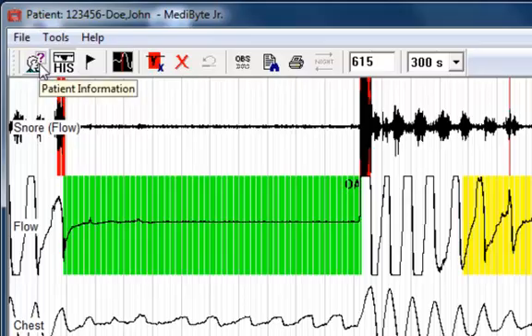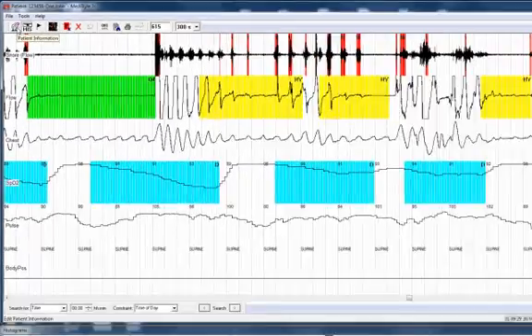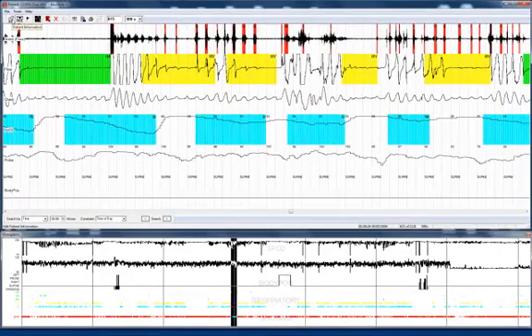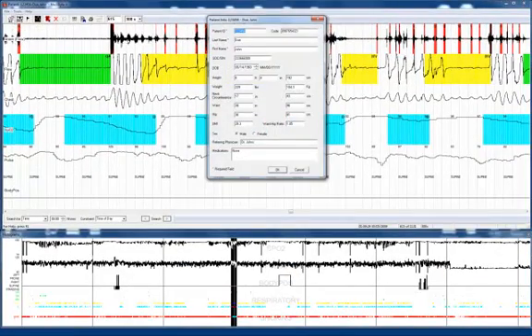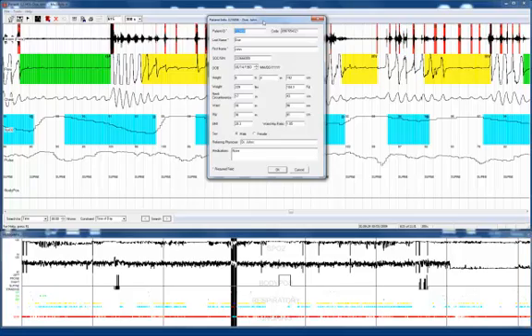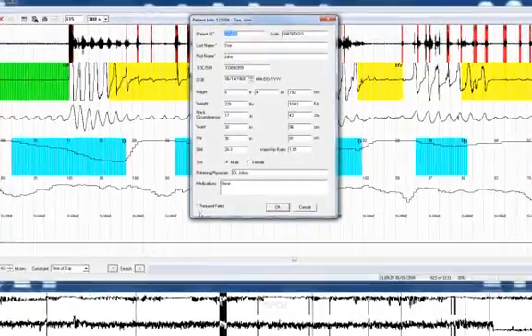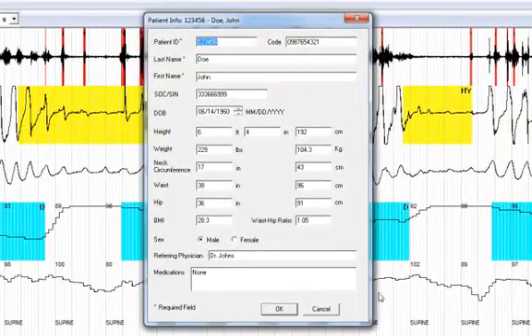First let's discuss patient information. If you click on the patient information toolbar icon, it will show you the patient information dialog box.